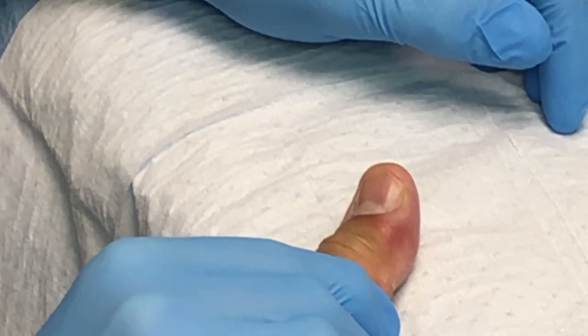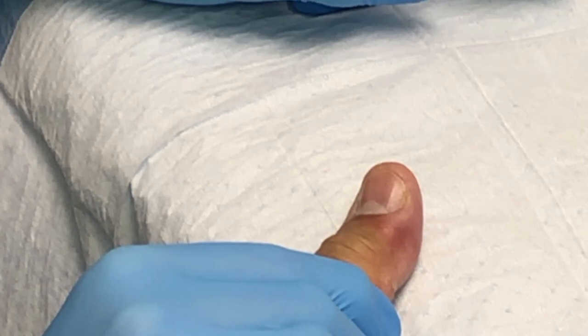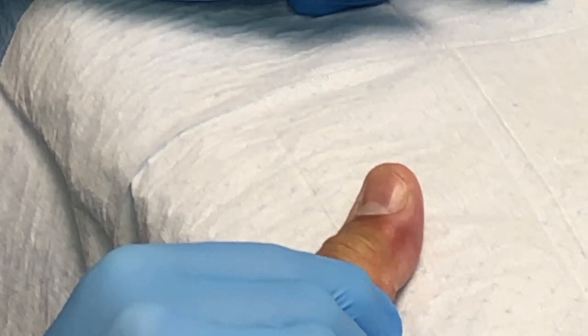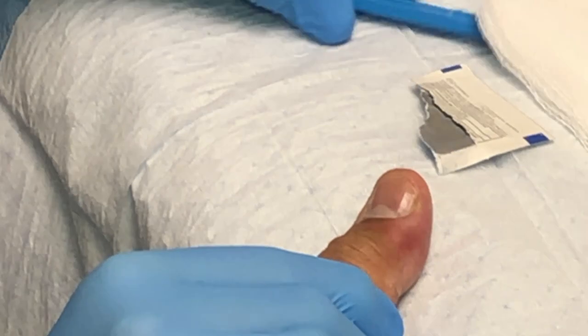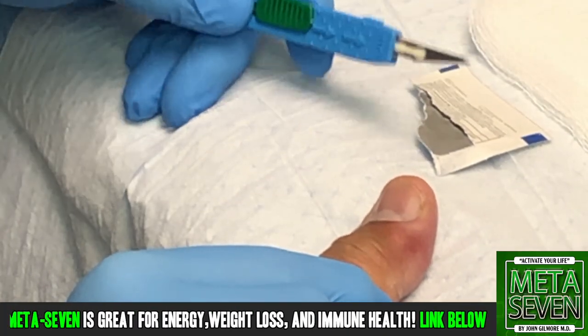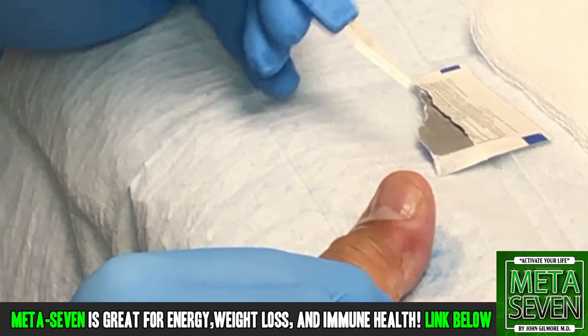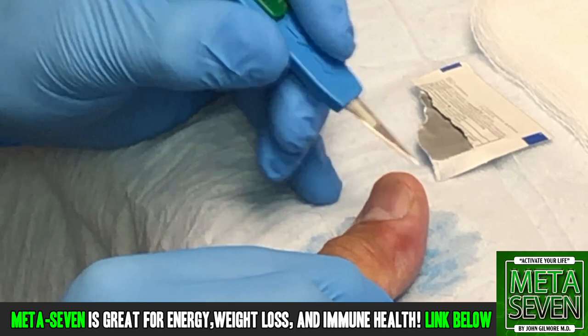Right now I'm applying pressure along the lateral aspect of the thumb, both sides, giving you a little mechanical anesthesia here. We've got a number 11 blade here. Gabby Jane, why don't you spray a little — right there. And we're going to open that up right now.